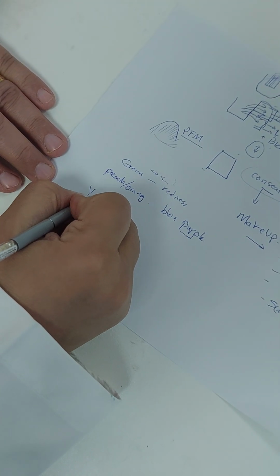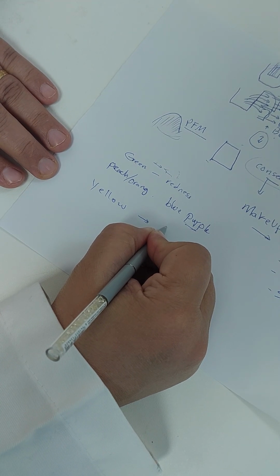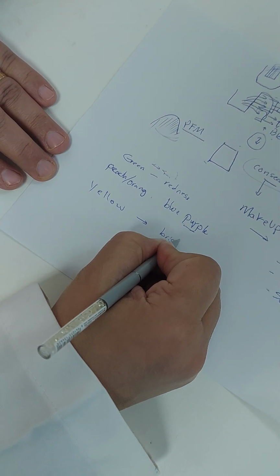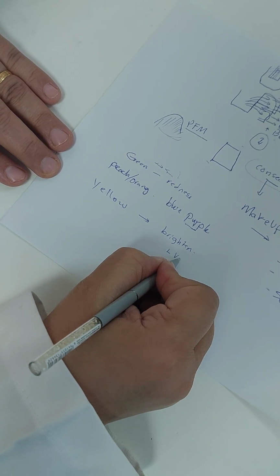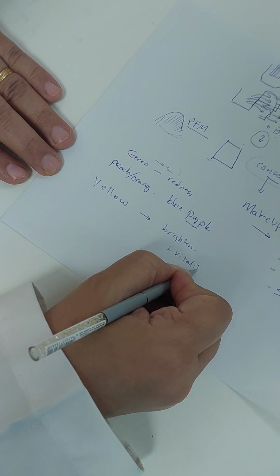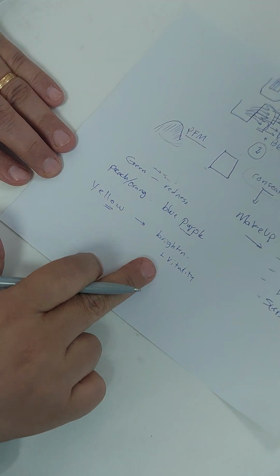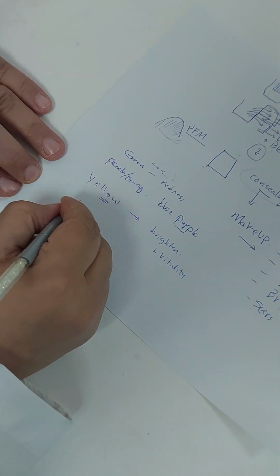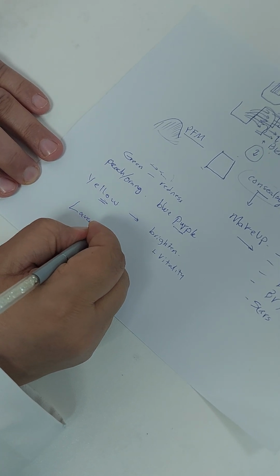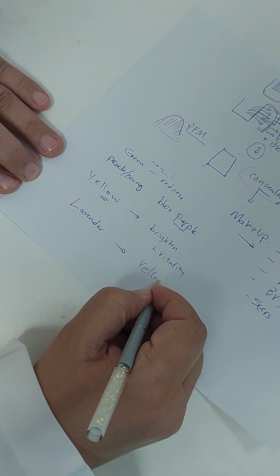Yellow could be used to add brightness. If I want to brighten the tooth, not change the color, I just want vitality, I could add yellow as a stain to give this vitality. Lastly, lavender could remove the yellow undertone.